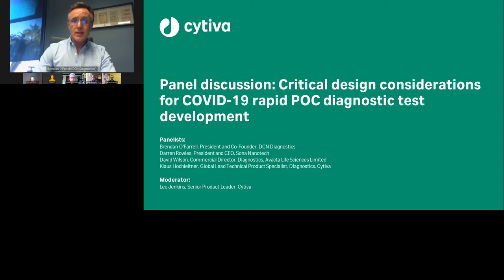On the serological assay or the antibody detection assays, these use binding reagents to detect the presence of antibodies directed against the specific viral antigens. So typically we're looking at IgG and IgM, although there's growing evidence that IgA has utility in the context of COVID. So serological assays are useful because a patient that's recovered from COVID-19, once the virus is cleared from the body, the viral RNA is no longer available for detection in the respiratory tract.